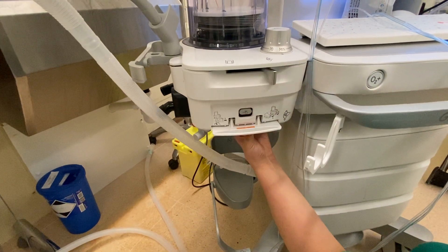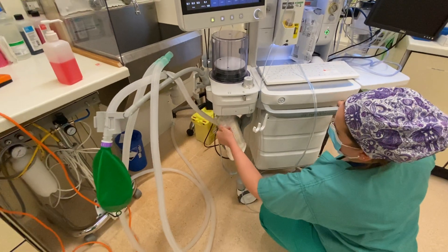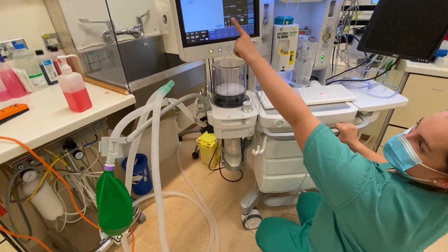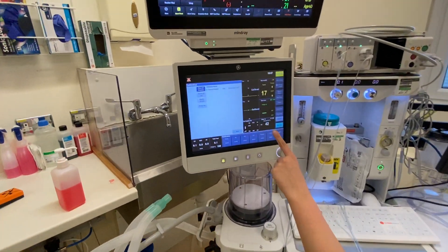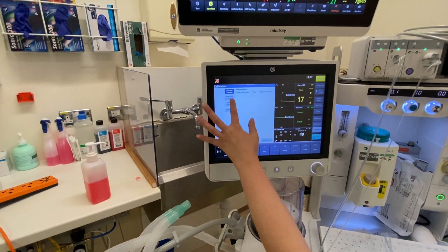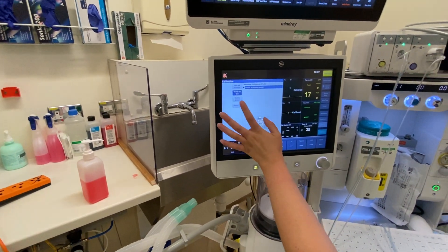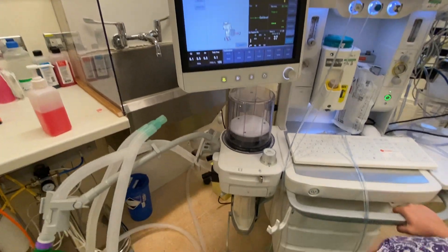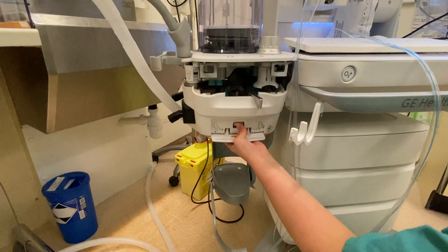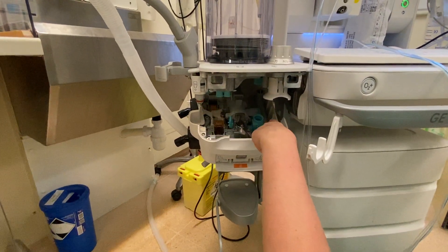So the next thing we do is relatch the breathing system and relatch the silo. It will say that it's passed on today's date and time. And then the next one to do is the weekly O2 cell, which is exactly the same as the last procedure. So that was the flow meters, and this is now the O2 cell. It's the exact same process and this sometimes takes a bit longer.